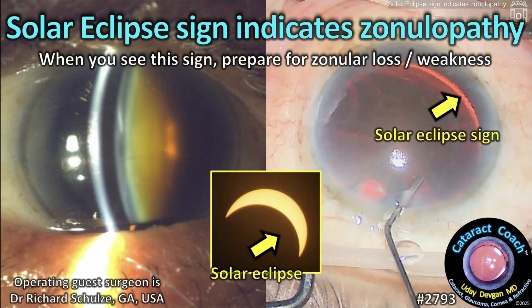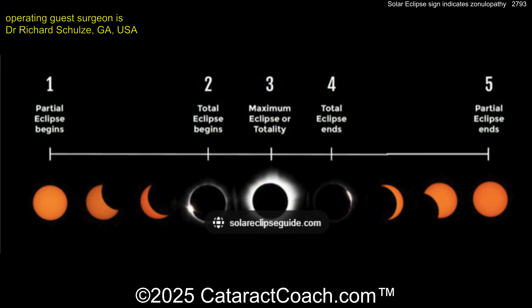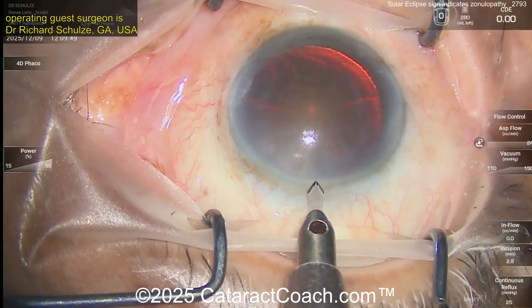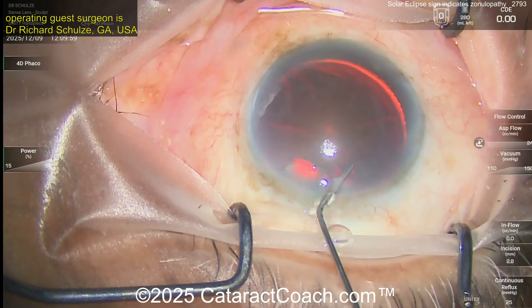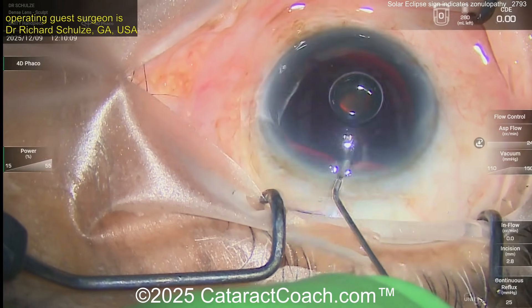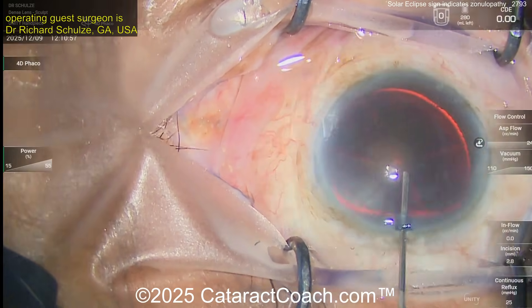From cataractcoach.com: the solar eclipse sign indicates zonulopathy. When you see the sign, think of the solar eclipse but remember to prepare for zonular loss or weakness. Here you can see a patient with a traumatic cataract. The solar eclipse sign refers to that sliver of light — look at the top of the screen from 12 o'clock to 3 o'clock — that's light from the red reflex coming around the lens capsular bag equator, indicating focal zonulopathy.